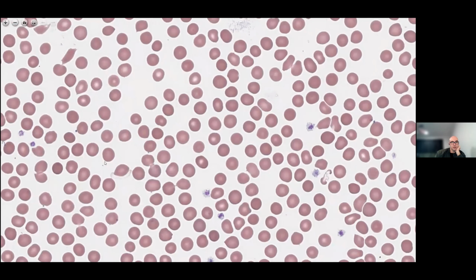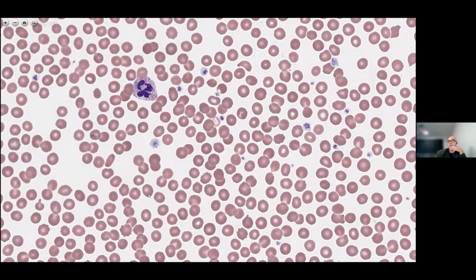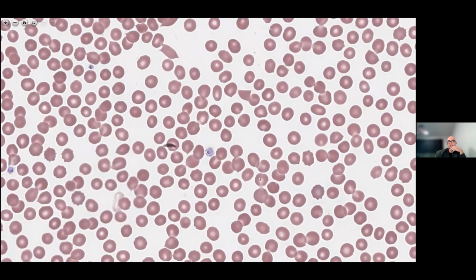And we're also seeing, what was it? The clinical notes was a bruising. So the clinician is querying, does the patient may have a bleeding tendency, unexplained bruising. So they've ordered a full blood count, probably with a barrage of other tests, like coagulation studies and ELFT for checking liver function, to see maybe we can find a cause for this bruising.